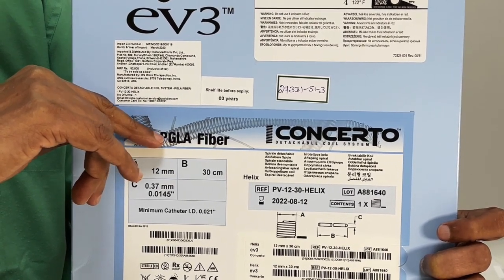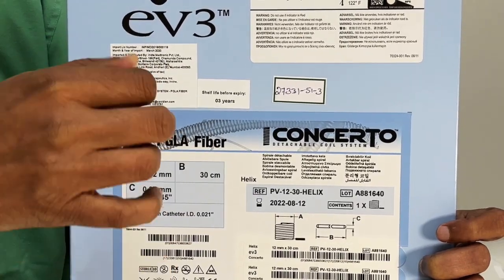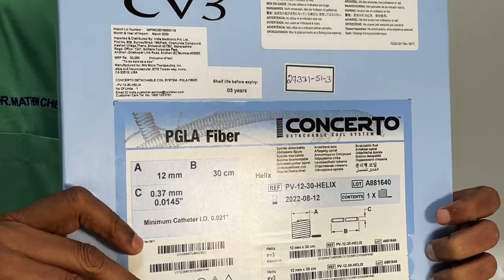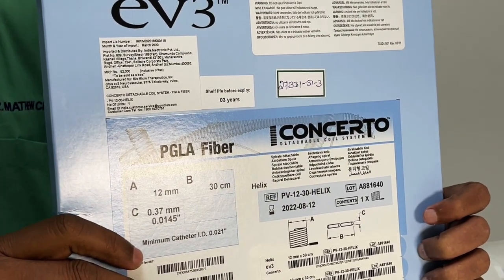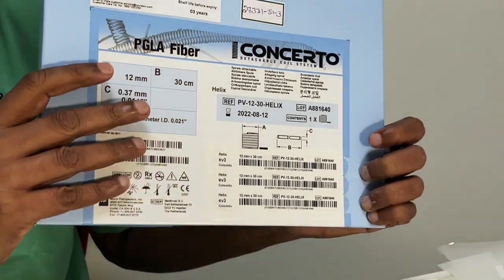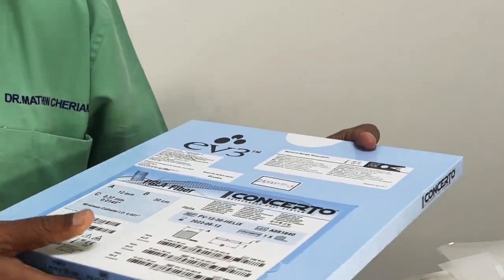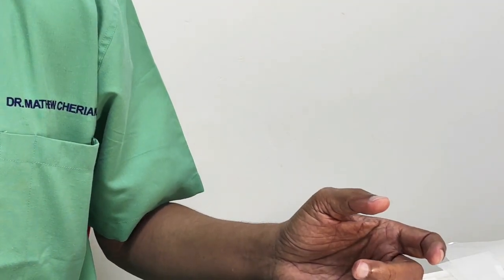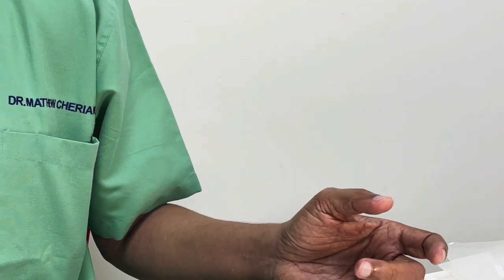And also there's a technique where you can break the tip and use it. Okay. So the other device is basically called an Amplatzer plug. The Amplatzer plug also works exactly like a coil. The only difference is that it has got a controlled detachment.